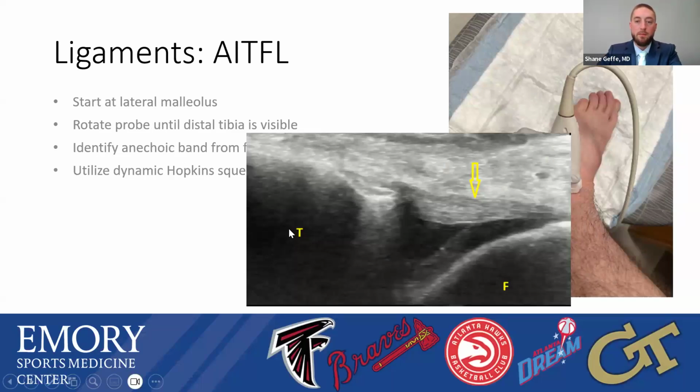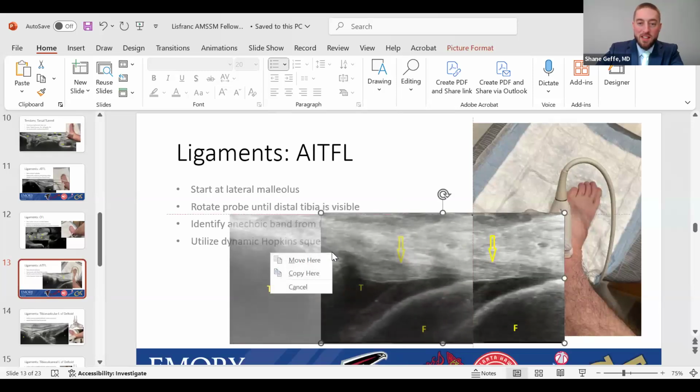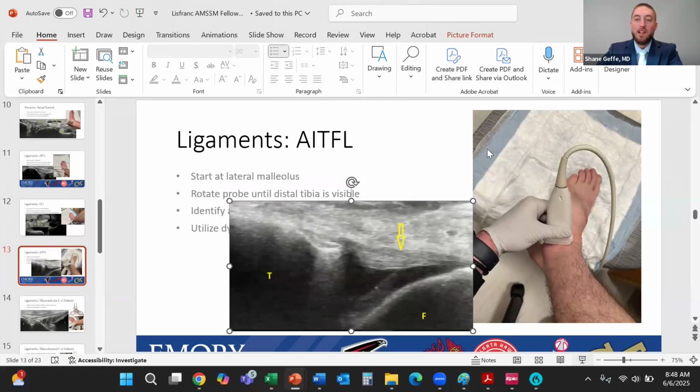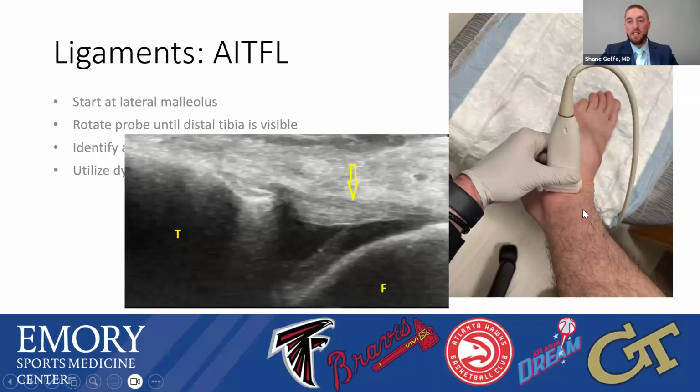As far as the syndesmosis, I don't typically look for the posterior inferior tibiofibular ligament. However, you can do that. I think most commonly I look in the anterior aspect of things. And what I'm looking for is, and honestly, we're just going to move this right now in real time. What I'm looking for is this type of placement. And so it's not as horizontal as you might think.